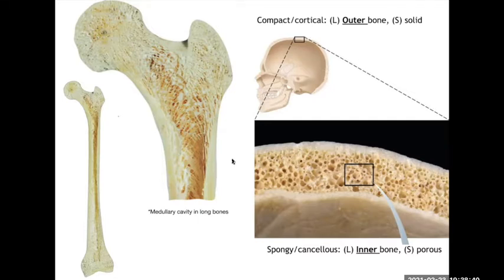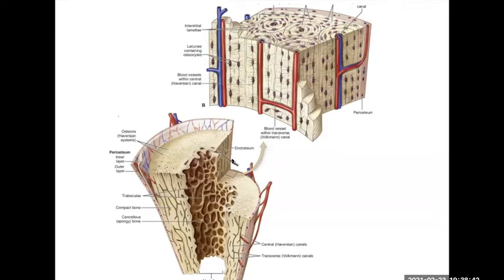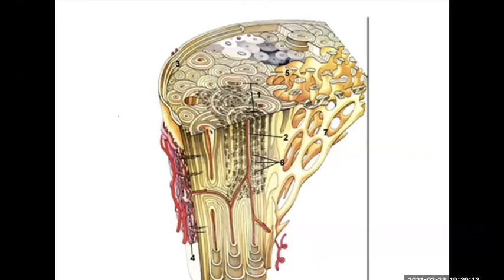All right. So bone, as opposed to, say, the connective tissue you looked at, is going to be very distinct, right? It's going to be much easier to conceptualize as far as the histology goes, because it has a very specific, highly organized tissue structure here. We're going to look at all these different features, inside and outside, and look at the overall picture. Again, this is just showing you the complexity of any particular bone right here.